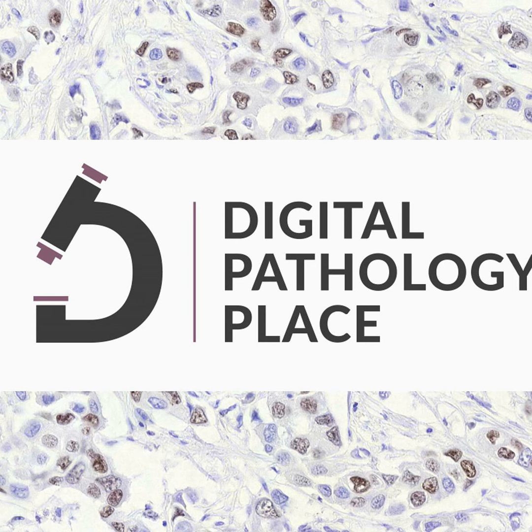Sure. This is where the computational assistance is really going to help out. And there are two main approaches to being able to do this. The first is to identify which phenotypes you're interested in. So you'll tell the computer, I'm interested in anything that's T cell positive through something like CD3. And if it's CD3 positive, is it CD4 or CD8 positive, to distinguish between two different populations of T cells. I also want to find my tumor cells. And you can tell the computer the list of phenotypes that you want, and it'll go in and find them based on certain intensity or other parameters that you might be distinguishing.